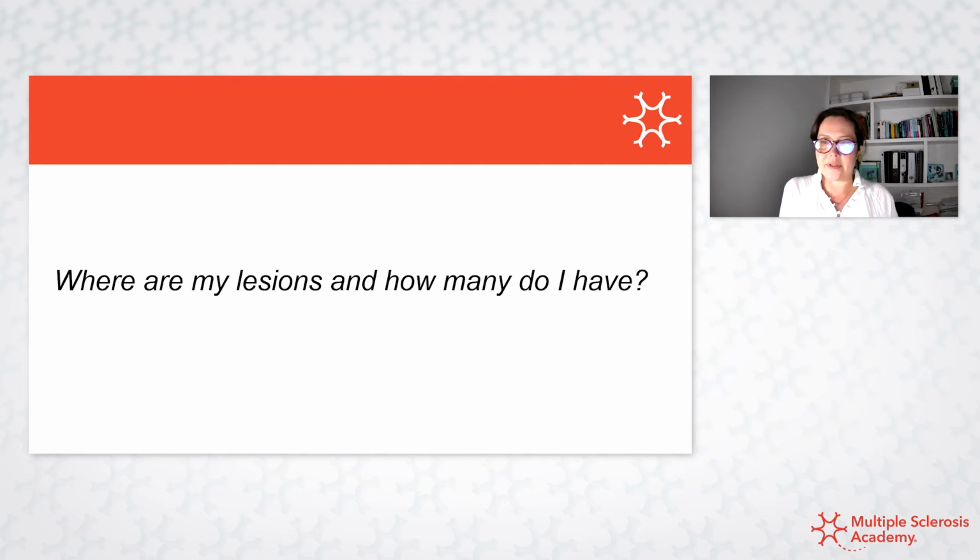If you've got somebody who's male, with lots of infratentorial lesions and a lot of cord lesions, I get a little bit angsty. So if I'm reporting in the district hospital that I visit, and somebody's got really quite aggressive looking disease, lots of lesions, lots of poor prognostic factors, then I put in my report to please refer. You may want to consider discussing this patient at the MDT. So I think it's important to have a ballpark figure of lesion number and where they are.